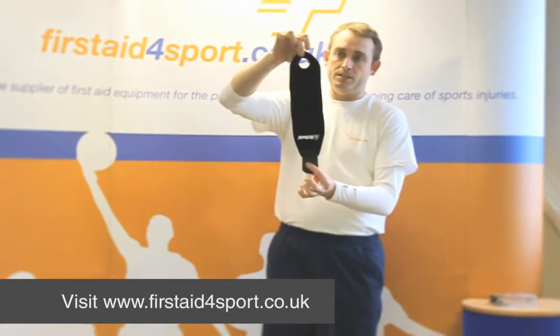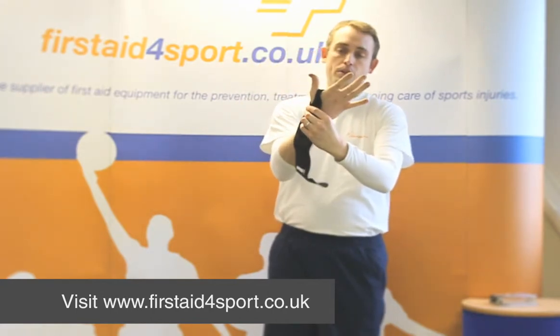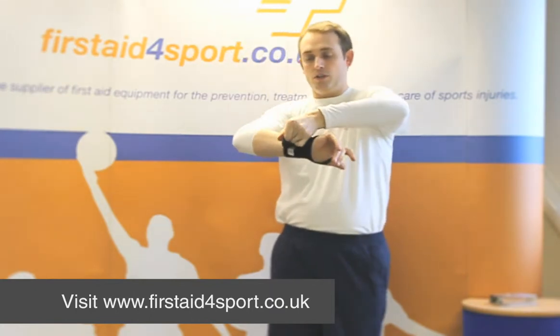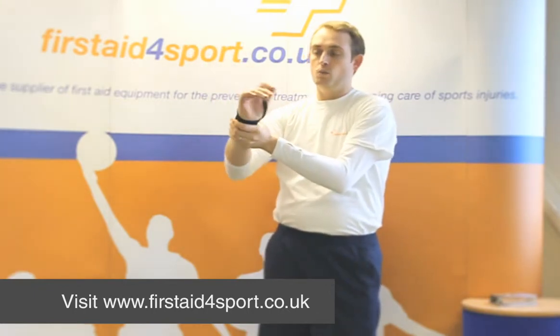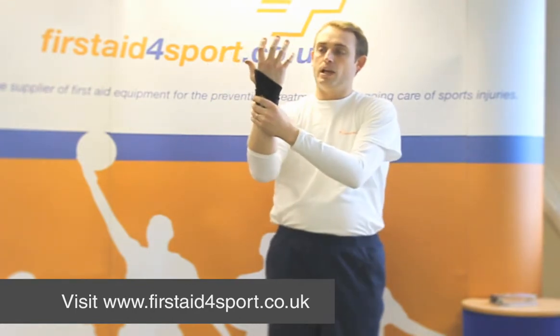It's one piece with a hole at the top, and you simply put your thumb in the hole, and then wrap the rest of the support around your wrist, and do it up with the Velcro. It offers some warmth and compression to the wrist, and the thumb hole holds the support in place.